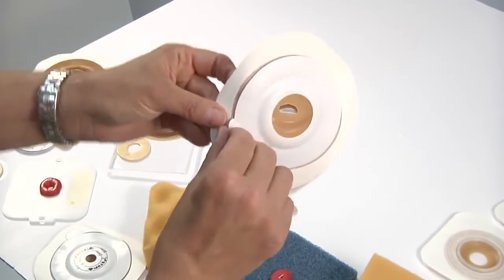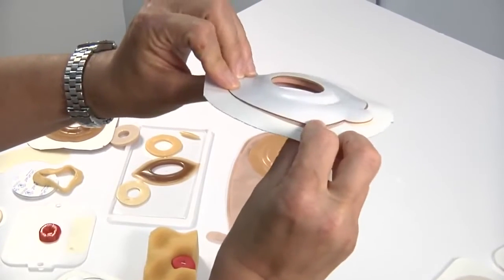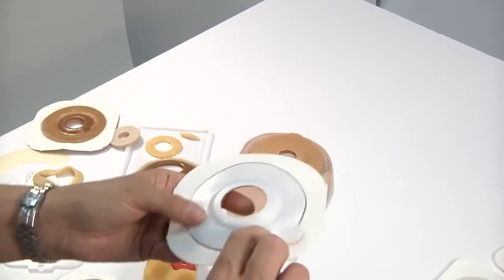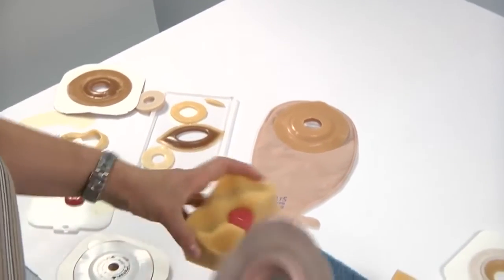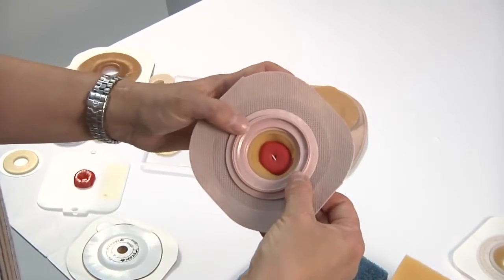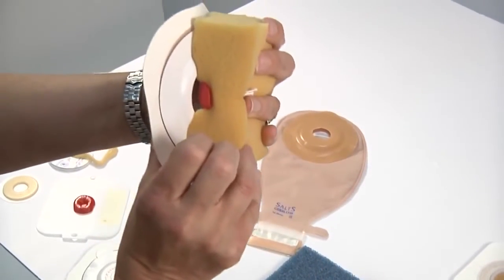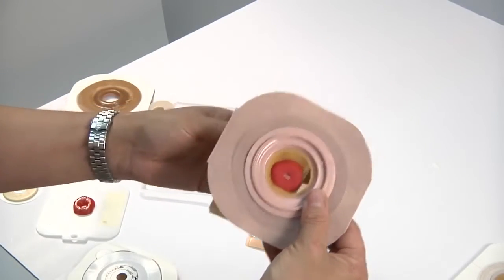So again, this is going to start to provide you with, most people would say that this is a medium level of convexity, and it would actually fill in that gully and crease. So with a little bit of tension, you'd be trying to figure out, does that actually distort it enough for me, or am I going to have to require something deeper?